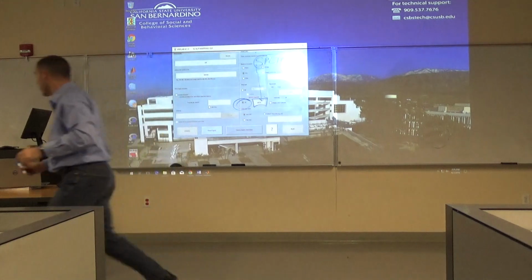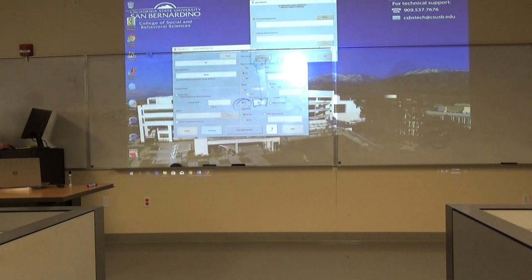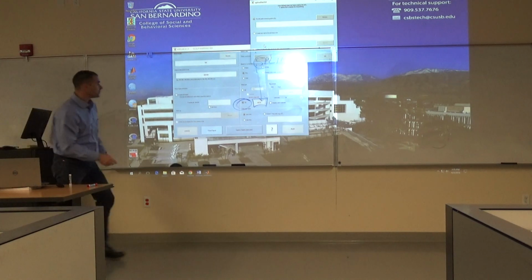Okay. So we've got to give it a file name. So let's hit this spline, and it asks us some information.